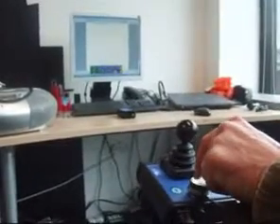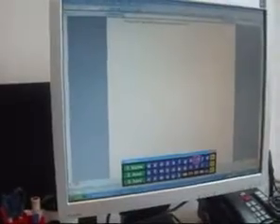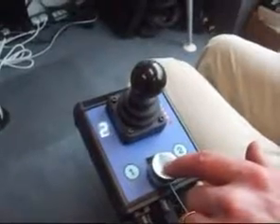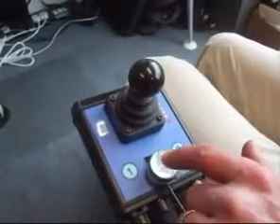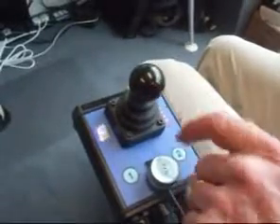Computer control is selected with the joystick. This is represented by the symbol C on the 7-segment display. A mouse emulator on the table is connected to the PC, and once the chair is within range, the joystick will control the mouse cursor. For this demonstration, an on-screen keyboard has been set up with a word processor, where the typing can be accomplished. The cursor is moved by the joystick over the desired letter.